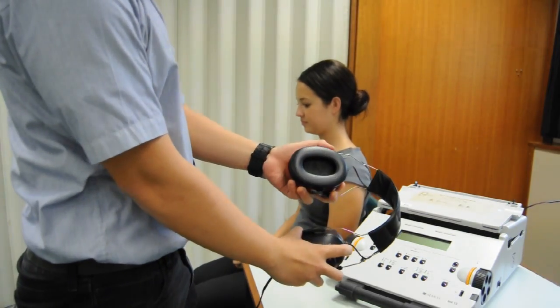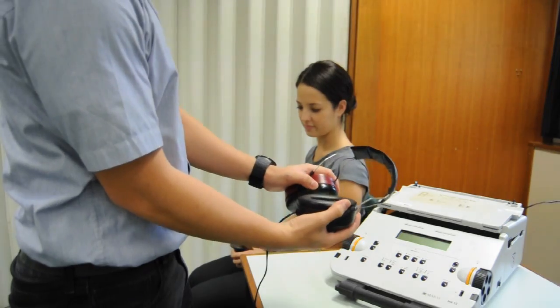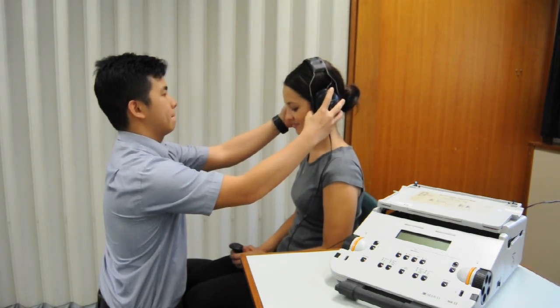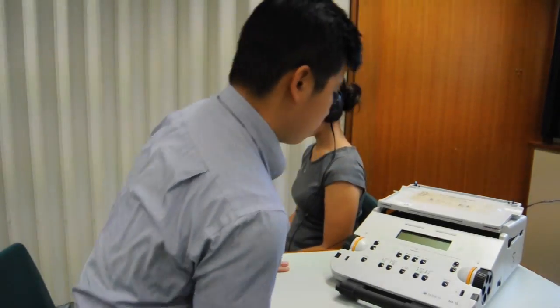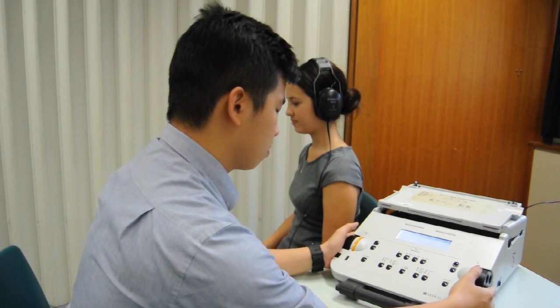The red headphone speaker should be placed on the client's right ear and the blue headphone on their left ear. The diaphragm of the headphone must be directly over the ear canal. Adjust the headphone band to fit the client. A clinician may choose to use insert headphones instead of conventional headphones if the client has collapsing ear canals or if there is significant background noise.